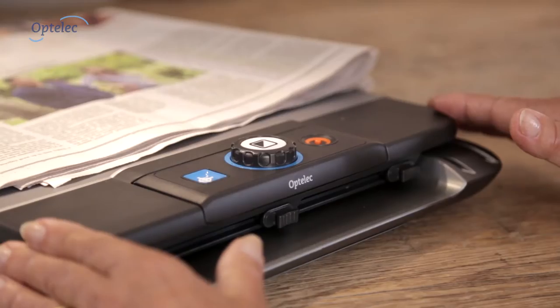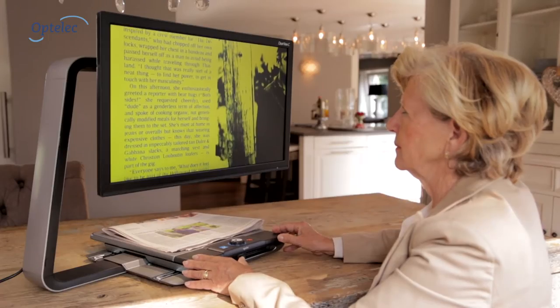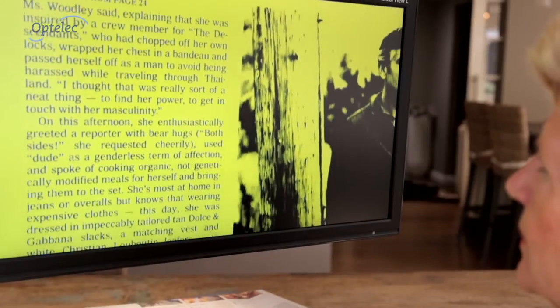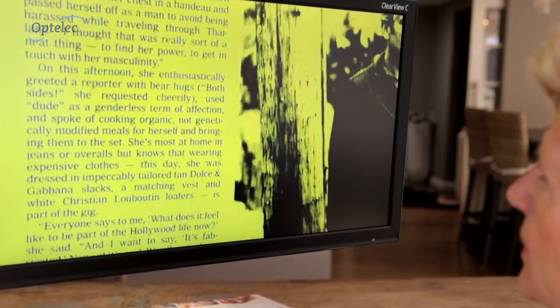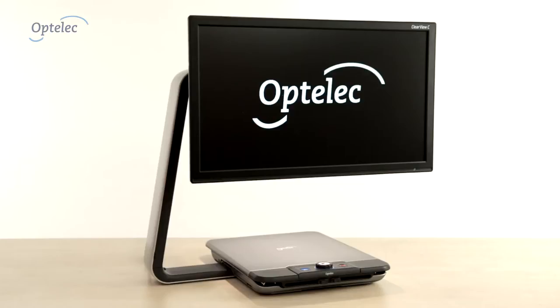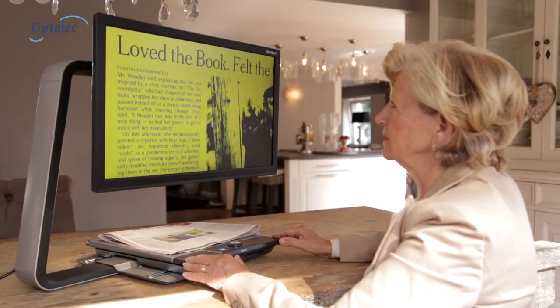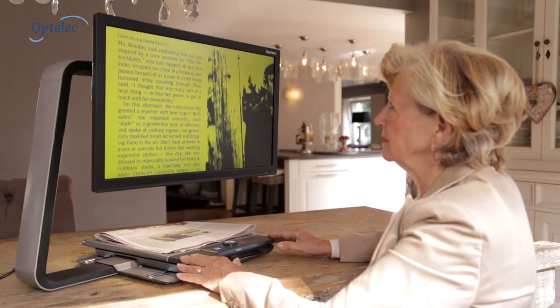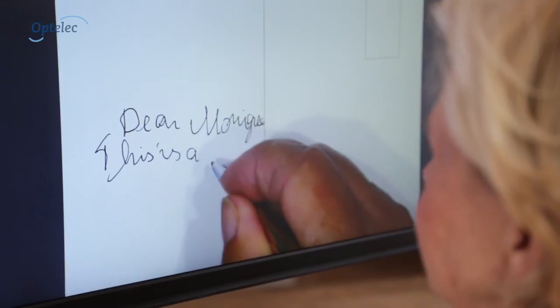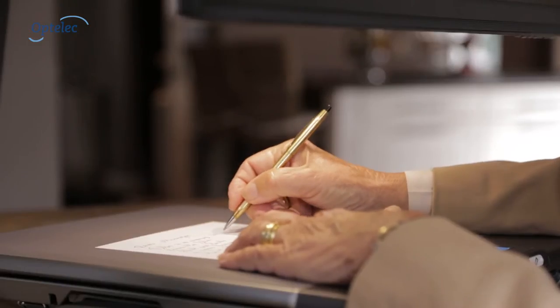The OptiLiq Clearview C is designed to improve your reading experience. It offers sharp magnified images in high contrast with optimal reading comfort. Built from high quality materials, the unique design integrates a C-shaped arm providing you with more working space. This helps you to read your favorite newspaper and to perform daily tasks such as writing a postcard without being limited in your movements.